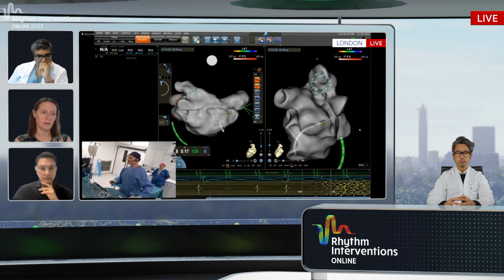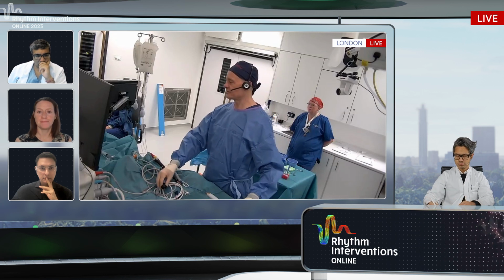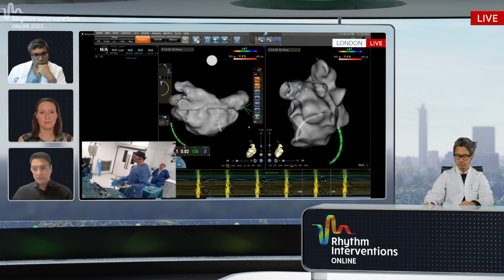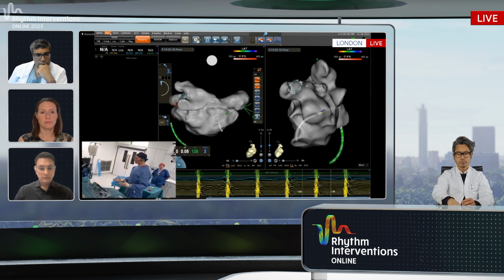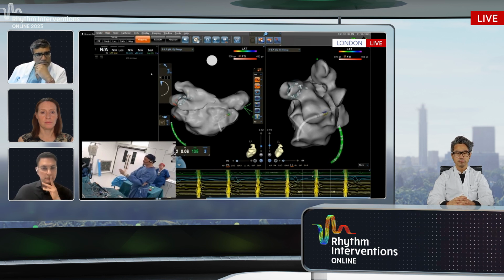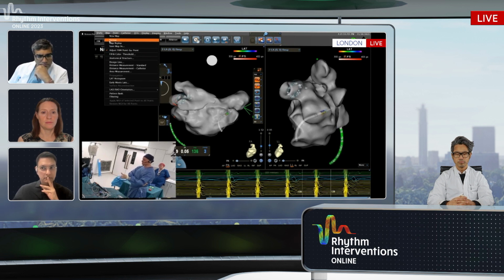So I'm now going to put the PV catheter into the appendage, and I'm going to use that as my reference. And the reason I do that is because it's a very atraumatic catheter. It doesn't cause ectopy like sometimes the Pentaray can. And it's very stable once it's in the appendage, so it ain't going to move. And if this is a left atrial tachycardia, then it's closer to the source than perhaps the CS is, and it won't get confused by far field V.